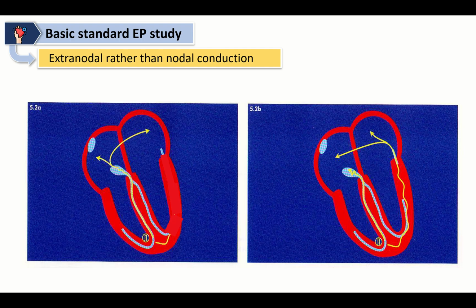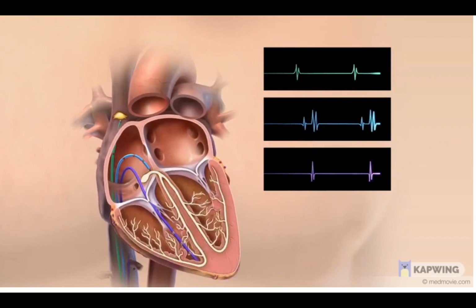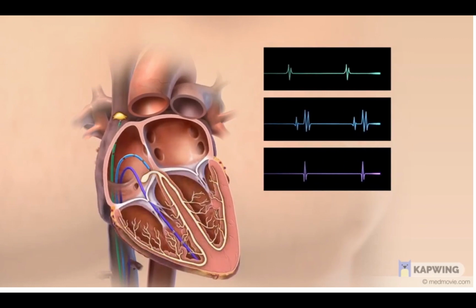It is eccentric conduction if it's a lateral accessory pathway. At the left side, the nodal conduction, AV node, it means the decremental conduction and the concentric activation, septal activation, ahead from the lateral. Okay, so now let's start the basic routine EP study, in which we will use our RV catheter, HIS, CS, high right atrium catheters.